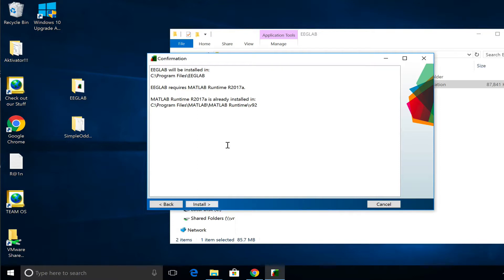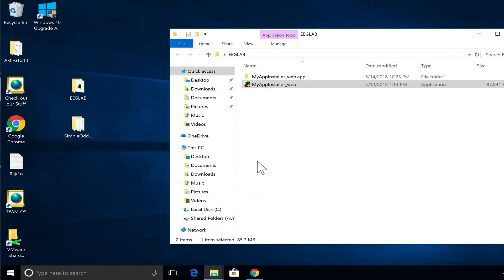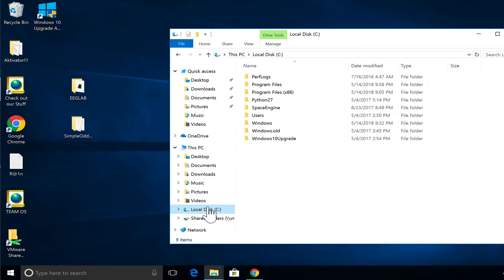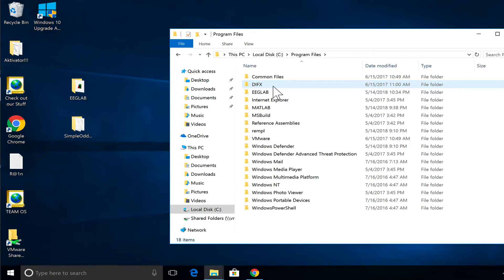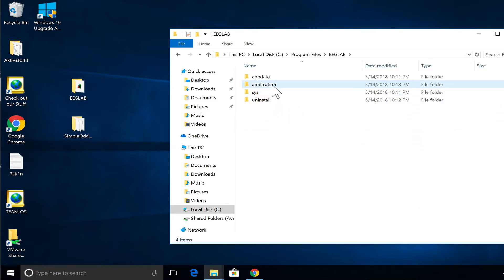I'm going to assume it has been installed — that's the case for me. So once it's done installing, what you would do next is go to your C drive and your Program Files — that would be your Applications folder on Mac — and then select the EEGLAB application.